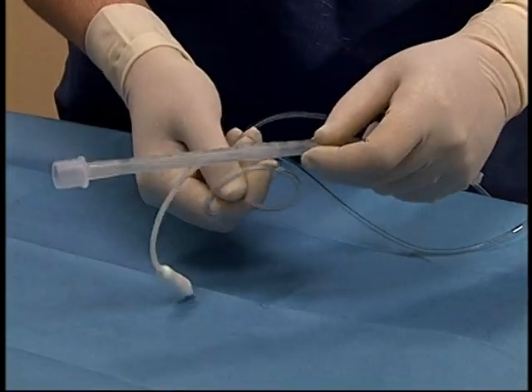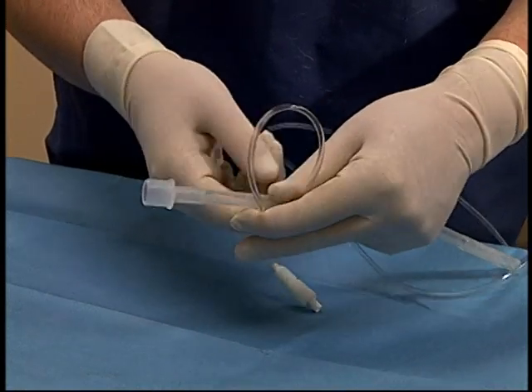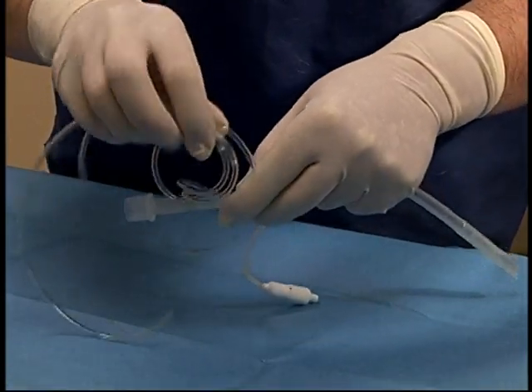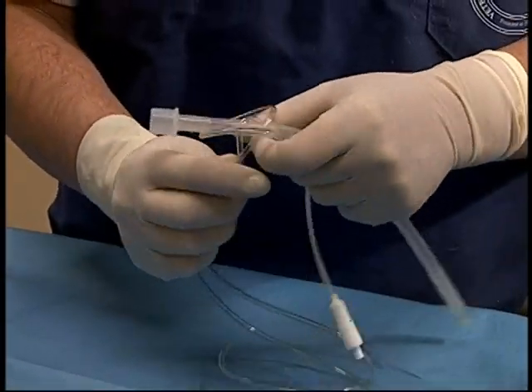In order to secure the tube, a pre-cut length of IV tubing is used. Strands are doubled and wrapped around the tube and then inserted through the loop that is created. This tubing should be pre-stretched to allow it to secure tightly on the endotracheal tube.